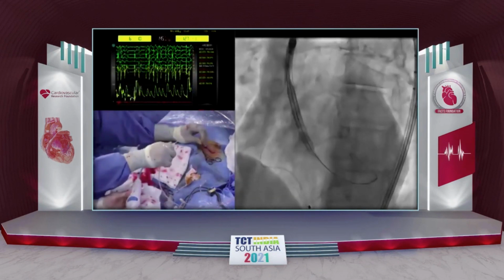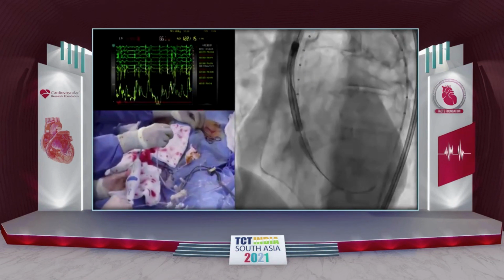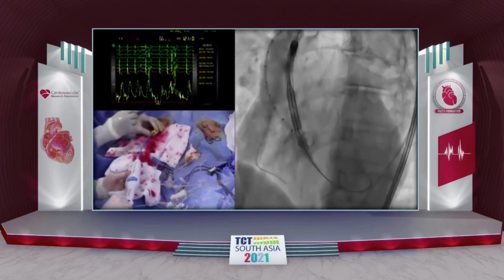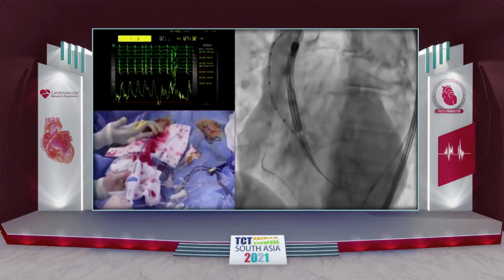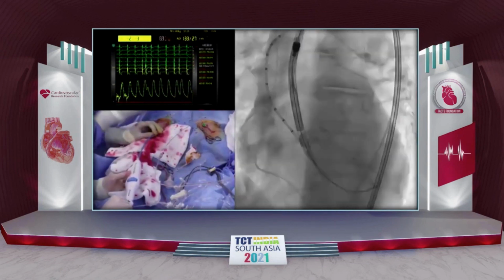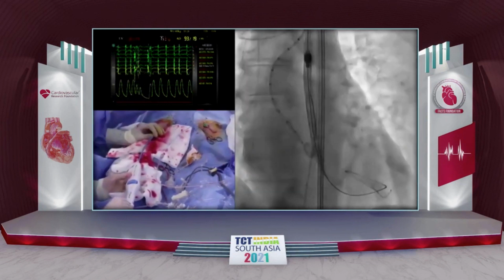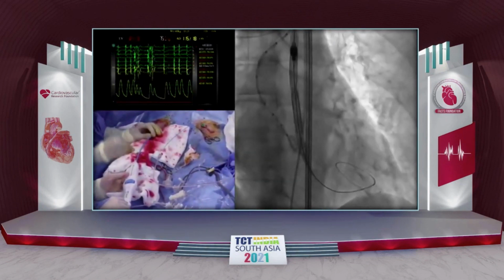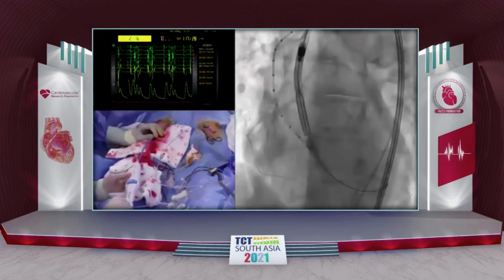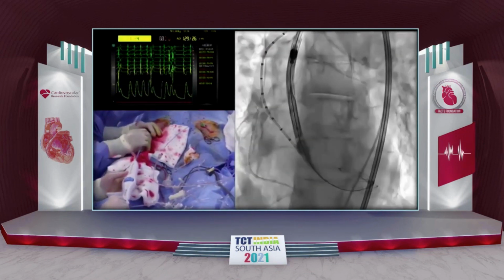Just stay where you are actually. So in terms of the frame alignment technique, the most important thing, which is true even for any other technique you use, is to make sure your pigtail is in the non-coronary sinus. We can do that by contrast injection, or the other way is to go to RAO 15. Now she is leaking a little bit, so I'm going to be reasonably quick. You can see that the pigtail is posterior to the catheter, so we know that it's the non-coronary sinus. Okay, let's go back to LAO 10. Let's go to normal fluoro. Okay, that's much better, I think.